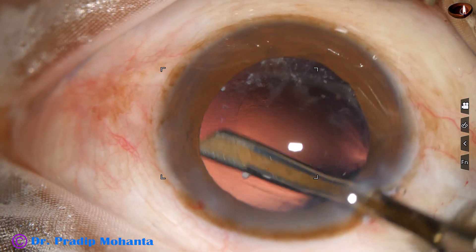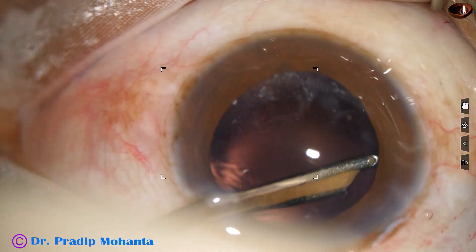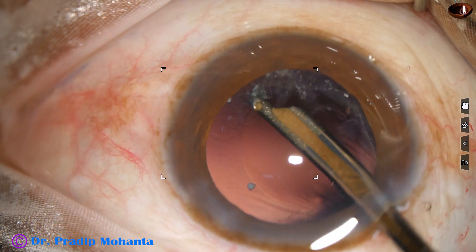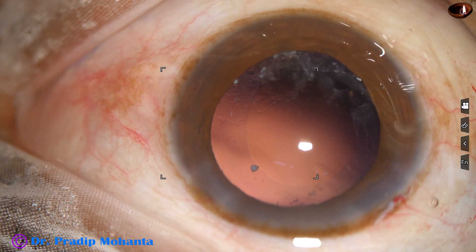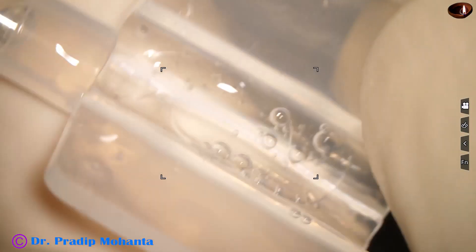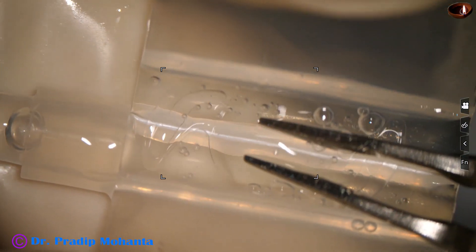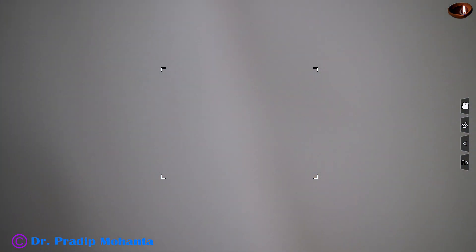We must take adequate time to remove the cortex. The side port width is such that this 23-gauge Simcoe can easily go in — it is about 1.8 millimeter. If the side port is 90 degrees away from the main wound, the astigmatism induced by the main wound is neutralized to some extent by the side port.